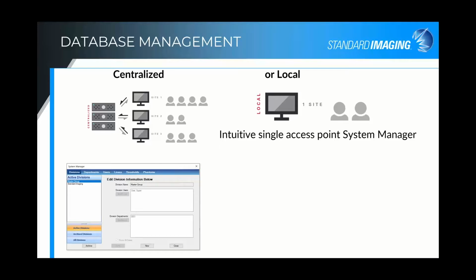But the nice thing about PIPSpro, if you're a single facility with just one or two LINACs, or you're a very large enterprise operation that has a number of different facilities, it's a very scalable package. You can scale it for enterprise or for that single facility very, very easily, and use it as you see fit for those types of operations.